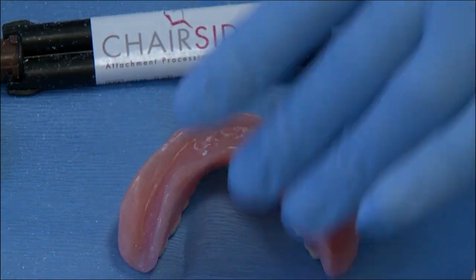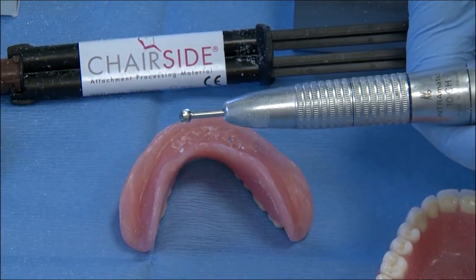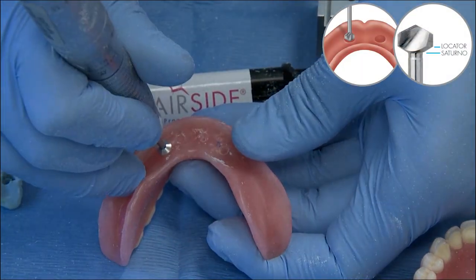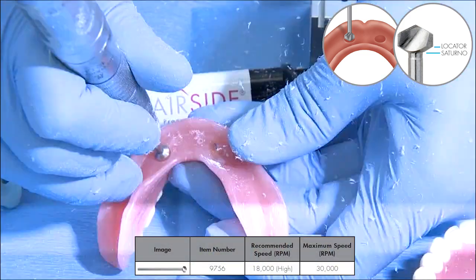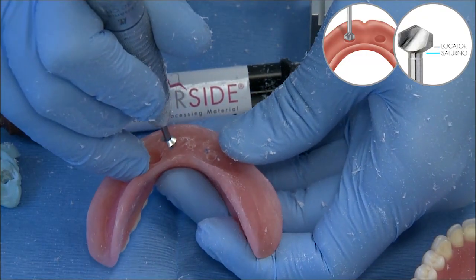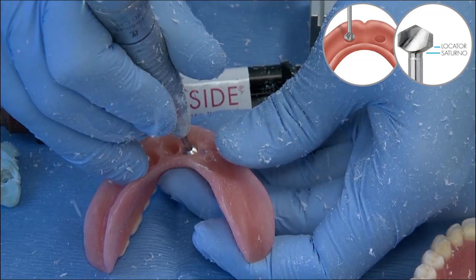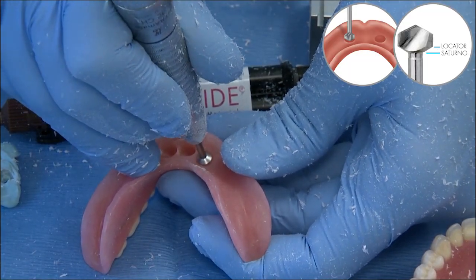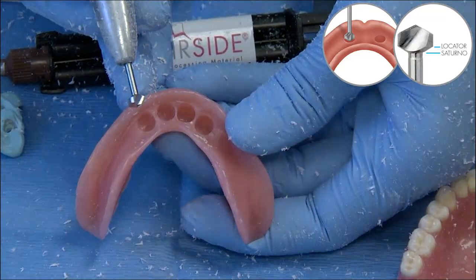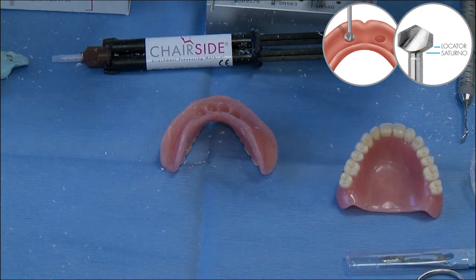At this point, we can air dry and clean off the dust, and you can notice that we've got four very precise round burr holes. After using the grind burr, I switch out to the recess burr. The chairside recess burr is used in a straight continuous motion, just vertically on the intaglio surface of the complete denture. A continuous force with light pressure is all you need. Slight pumping in and out can help get the burr started. I continue with all four burr marks, sizing the complete denture recesses for the locator attachment, as shown in the upper right of the screen. The widest portion of the burr when its superior edge touches the intaglio surface is for the locator attachment; dropping in further is for the Saturno attachment. I may need to go a little deeper here because the implants were placed with pretty high attachments.